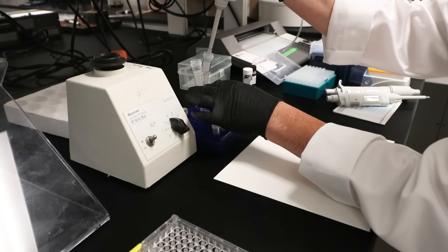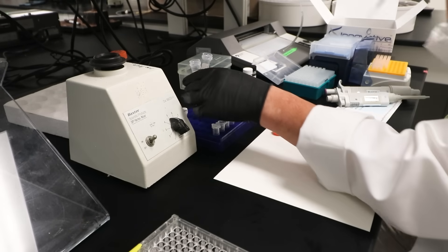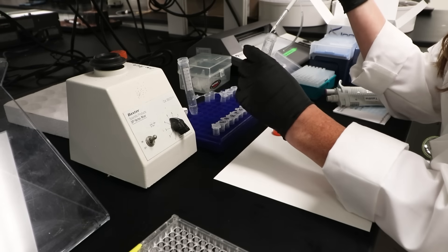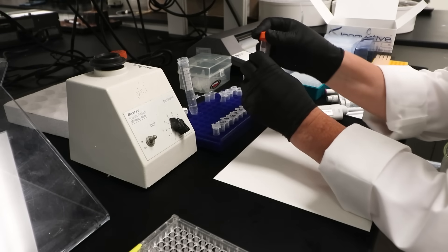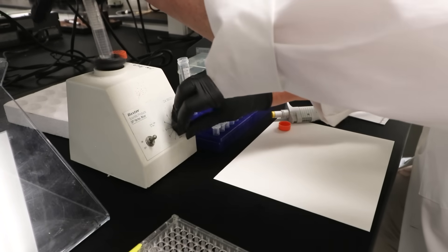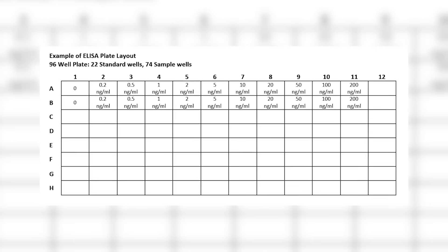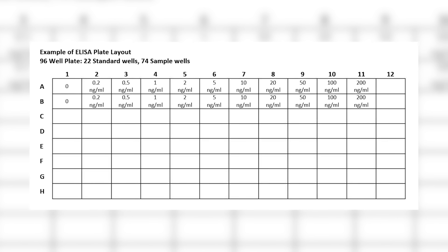Next, we'll prepare the standard. Reconstitute the human IgG standard by adding blocking buffer and mix well. Then prepare the dilutions according to the provided table. Be aware that dilutions for the standard curve and zero standard must be made and applied to the plate immediately. There is an example plate layout in the instructions. We recommend using a horizontal table layout instead of a typical column-based layout to increase precision and decrease the likelihood of human error while preparing the standard.